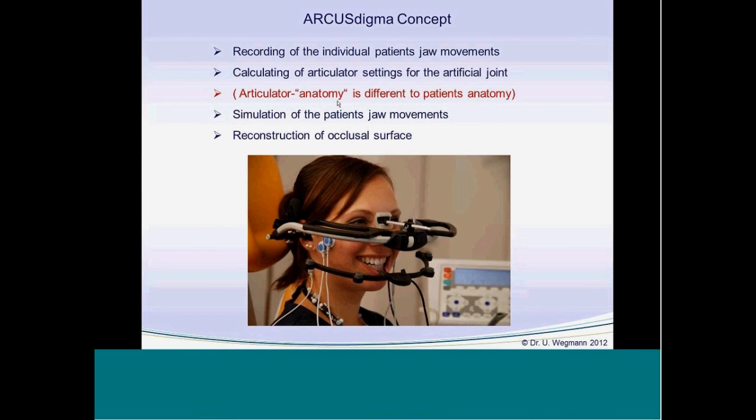We have to know the movements, we have to transfer settings for this articulator. And then it's very simple to adjust the articulator to the right values, to the right guidance for the movements. Okay, that's the most important point to know. Articulator anatomy is no longer the same as the patient's anatomy.